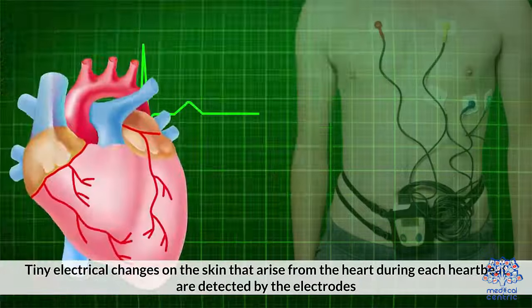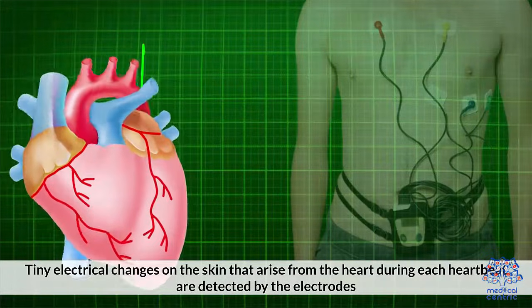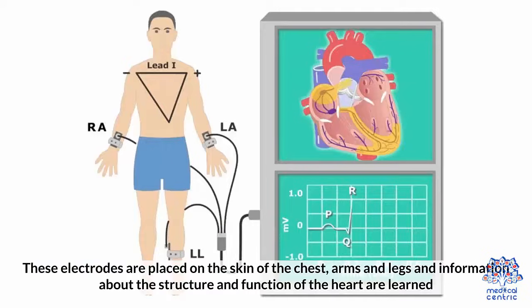Tiny electrical changes on the skin that arrive from the heart during each heartbeat are detected by the electrodes. These electrodes are placed on the skin of the chest, arms, and legs, and information about the structure and function of the heart is learned.